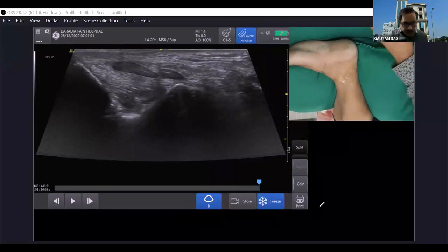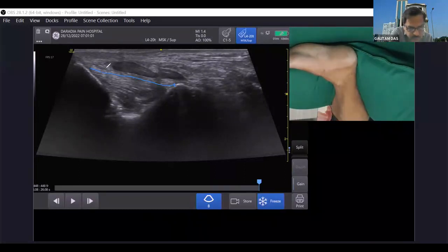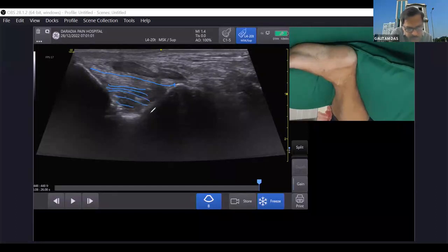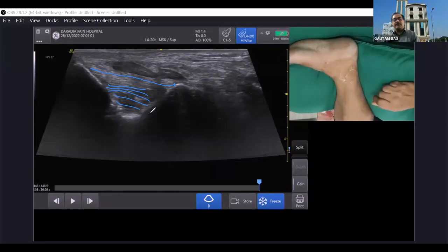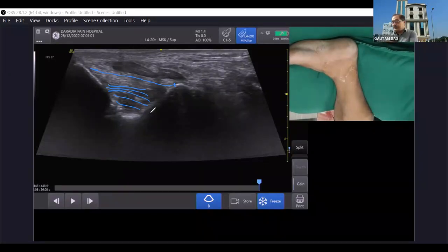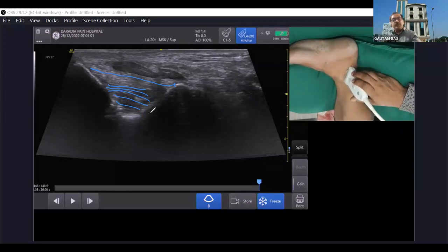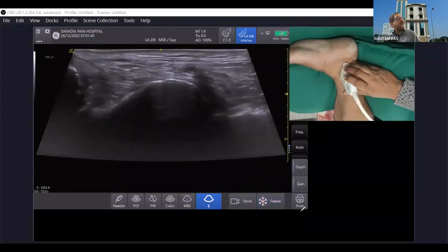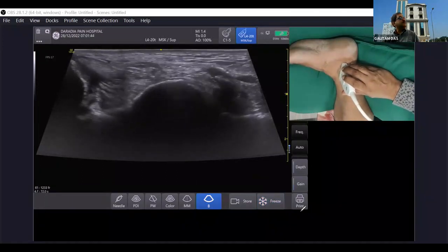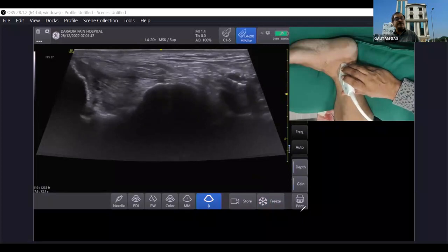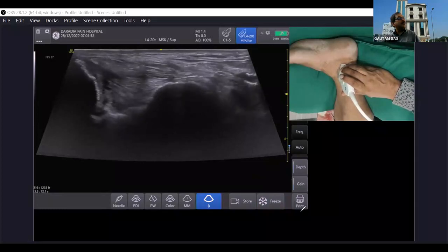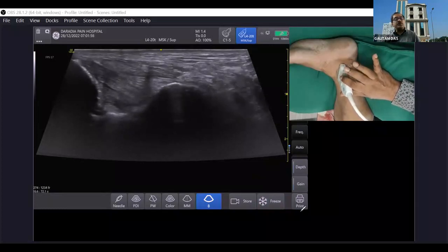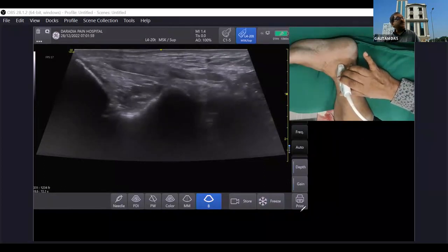This was the superficial tibiotalar ligament, and the black-and-white banded pattern below it is your deep posterior tibiotalar ligament. From this point, moving in a fan-shaped manner more anteriorly, all the ligament layers — both superficial and deep — are very nicely seen. Tilting the probe, the sustentaculum tali is appearing as another bone.